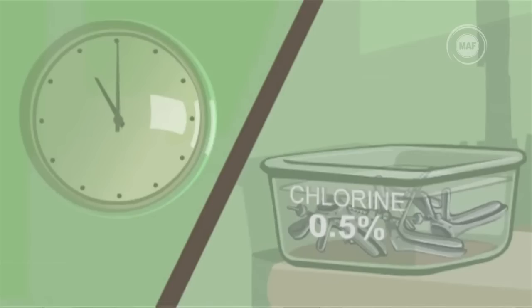5% acetic acid is prepared by adding 5 ml of glacial acetic acid into 95 ml of distilled water. If you are using vinegar bought from a store, make sure the vinegar is labelled as 5%. Ideally the brand should also be tested by a laboratory to check it is actually 5%. You'll need to make sure that all the equipment you use has been properly decontaminated and disinfected.